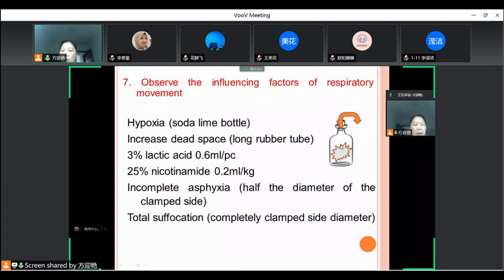Then, due to that, he inhaled the oxygen, and then he exhaled the carbon dioxide. The carbon dioxide can be absorbed by the soda.